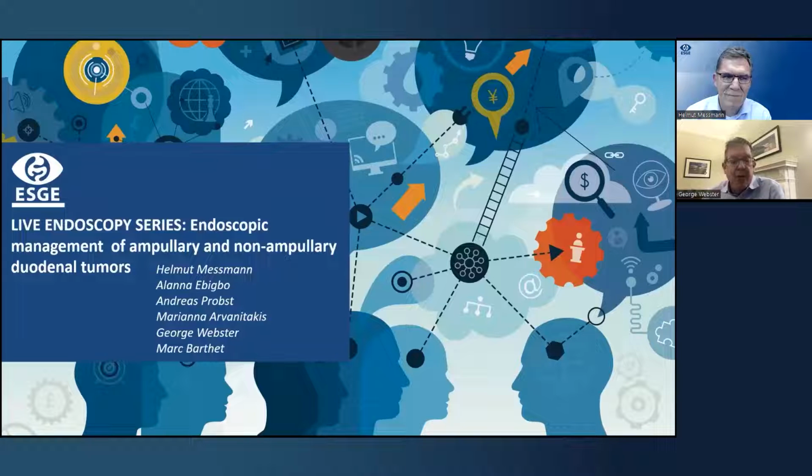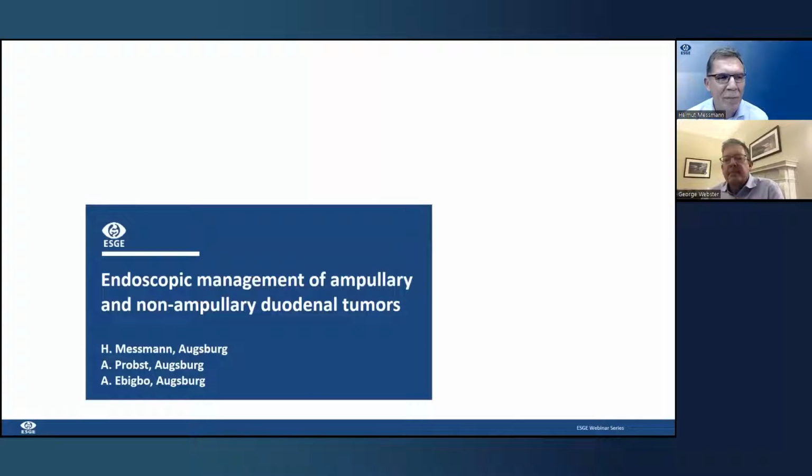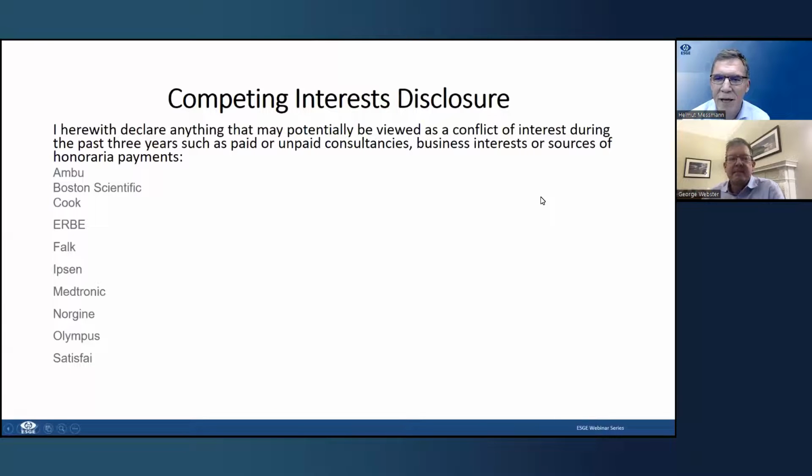So I think we're pretty much ready to get going, and as you said, we have Marc Barthet as an expert also invited, and Marianna will explain the guidelines of ESGE. So the idea is always to have the guidelines at the background. Is this correct what we do? And I'm also happy to have my co-workers Alanna Ebigbo and Andreas Probst, who do a lot of ESD and EMR in the duodenum. So we start with the first case, and yeah, these are my disclosures.